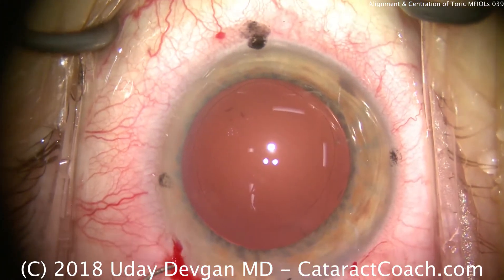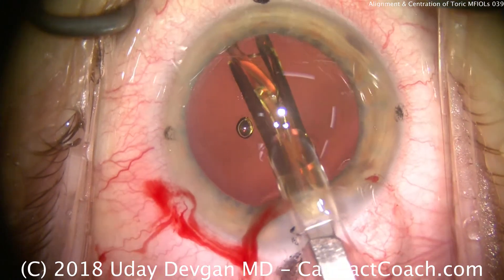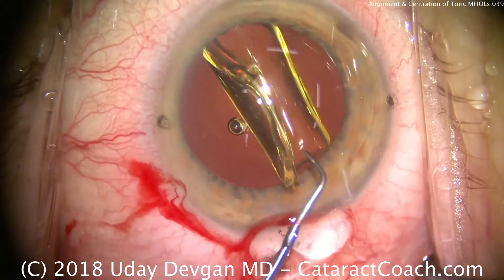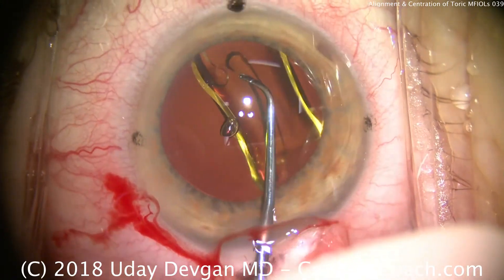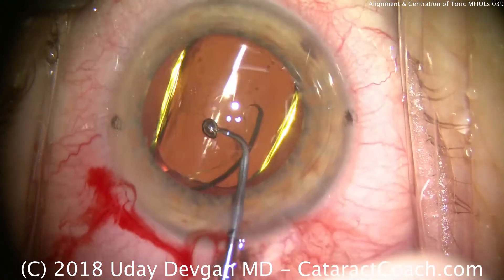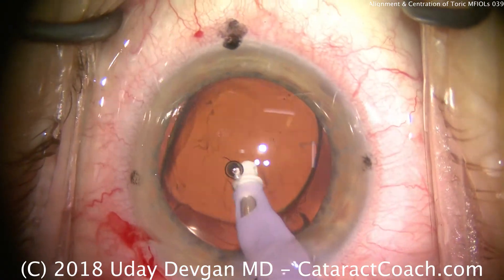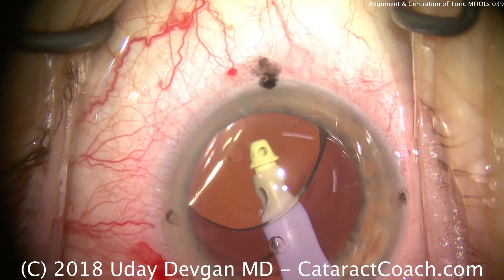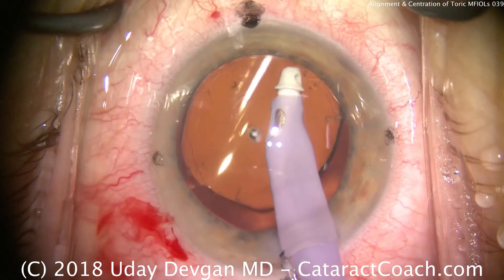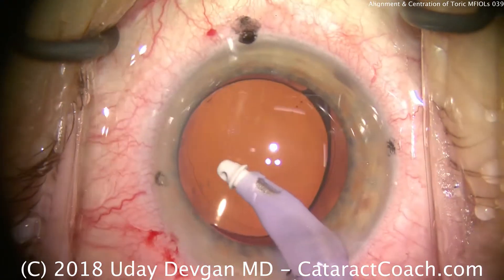We're going to use the microscope lights — these Purkinje reflexes — to line up the lens. The IOL goes into the capsular bag; make sure it goes under the nasal rhexis. Using the chopper, we'll align the lens, make sure the entire lens is in the capsular bag, and rotate it just shy of its final position. The arms are opening up beautifully. The irrigation aspiration probe goes under the optic — this is a very important step. You have to remove the viscoelastic from the capsular bag and from behind the optic; otherwise it'll prevent the optic from being tacky and sticking to the capsular bag. The lens will be slippery and it'll move. Now remove the viscoelastic from the anterior chamber as well.